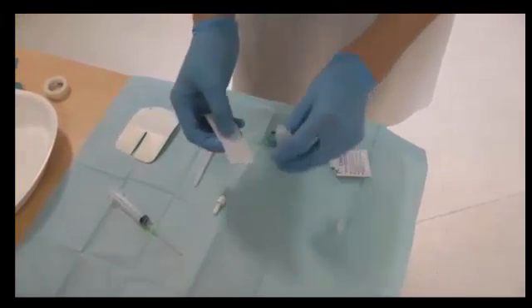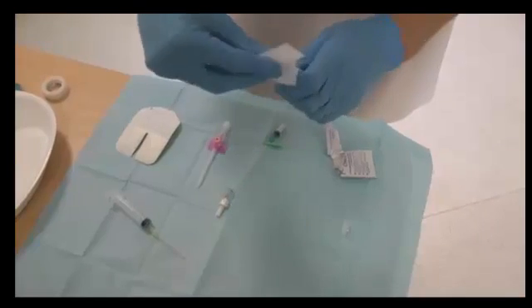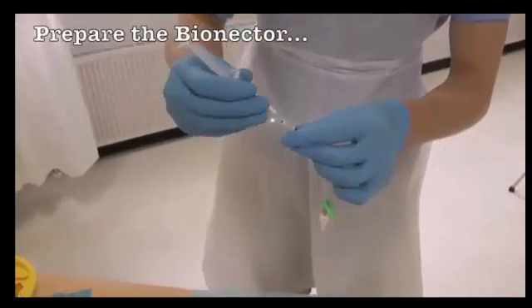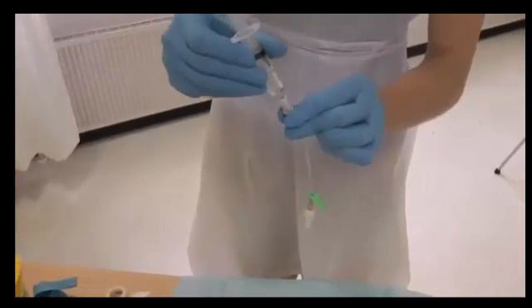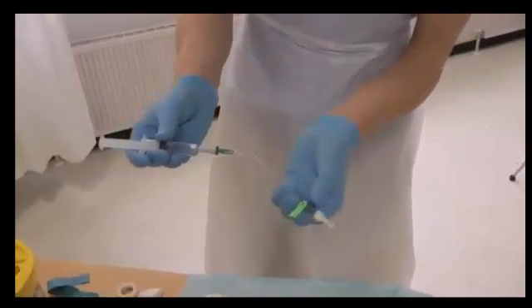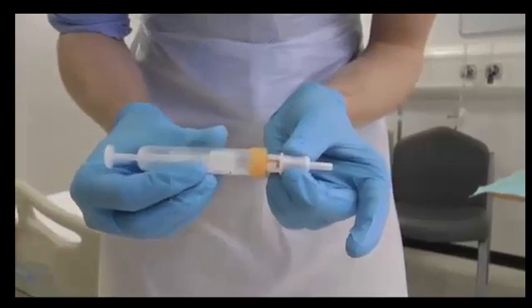Check the saline is in date and clean the bottle with an alco wipe. Draw up your flush using the needle and syringe. Prep your Bionector with a small amount of saline — this is to remove the air. Prepare any blood bottles by connecting them to the adapter.